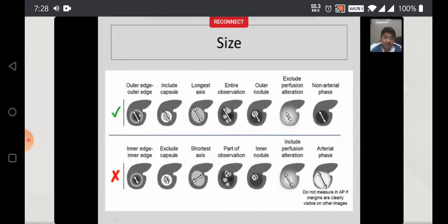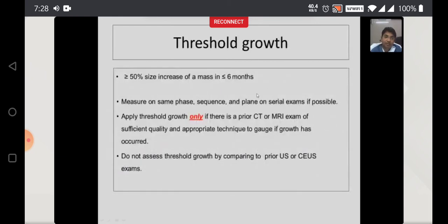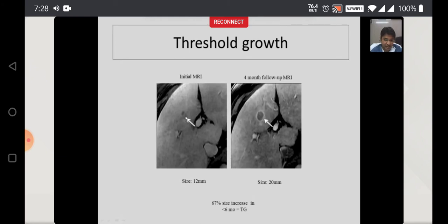How do you measure size in hepatic nodules? Measure from outer edge to outer edge, include the capsule, take the longest axis, include the entire observation including the outer nodule, do not include perfusion alteration, and mostly do not try to measure liver lesion size in the arterial phase. Threshold growth is more than 50% increase in size of the mass or nodule in less than 6 months. For example, a lesion of 12mm increasing to 20mm in about 4 months is a 67% increase in less than 6 months — that means there is threshold growth.